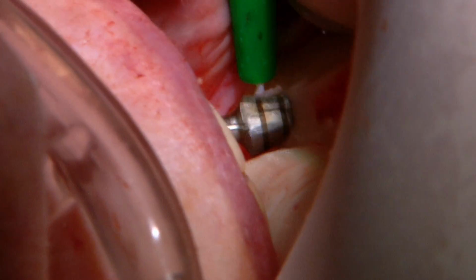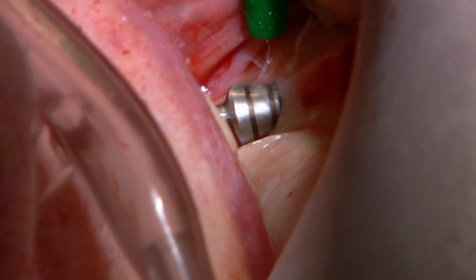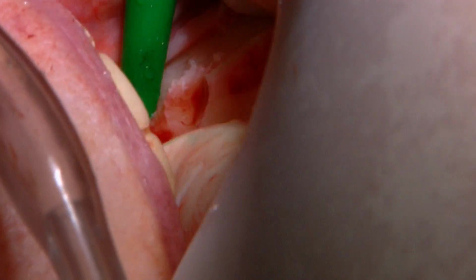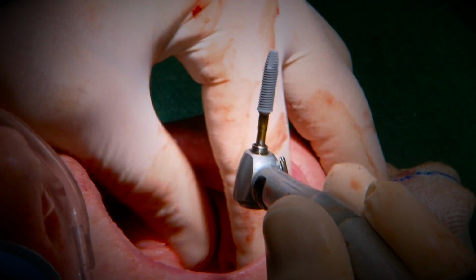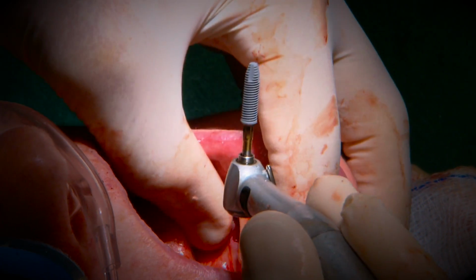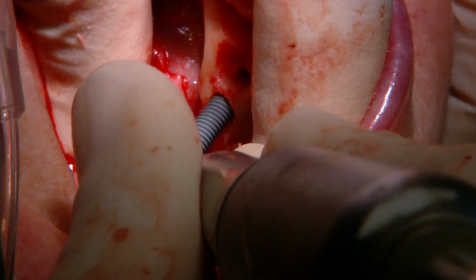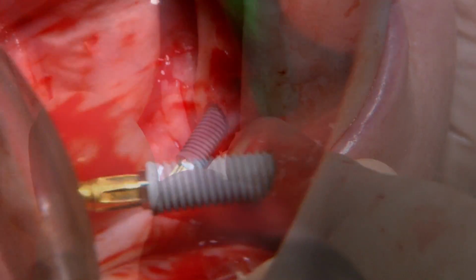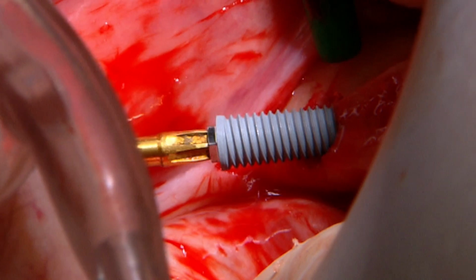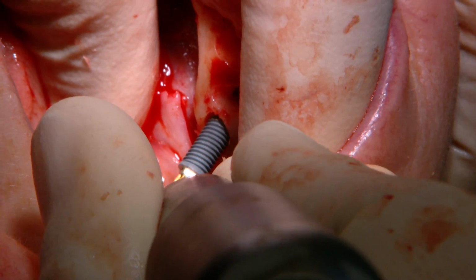What we're doing now is just removing the excess bone from around the top where the implant's going to be. We call this countersinking. So our next step is to tap our implants in. 15mm Nobel Biocare implant. These implants are made in Sweden. They just tend to be, we find, and they are, the most researched implant and one designed specifically for this procedure. So we know our angle. And just like a self-tapping screw, it'll actually find its way into the hole we've made.